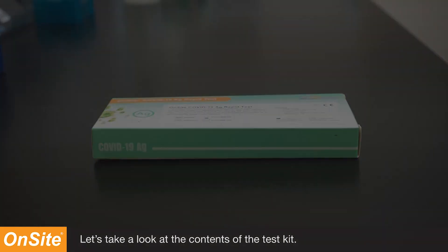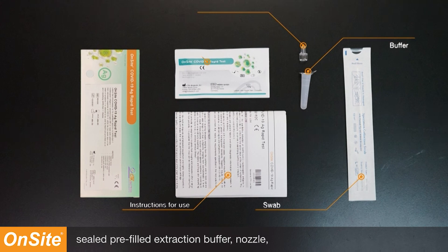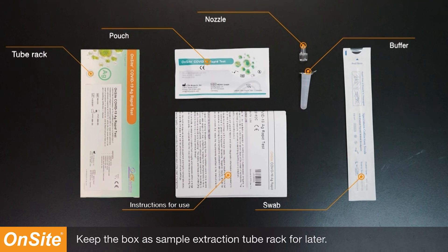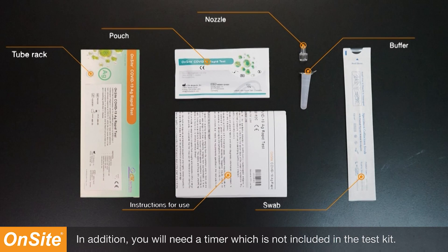Let's take a look at the contents of the test kit. Our kit contains instructions for use, swab, sealed pre-filled extraction buffer, nozzles, and individually sealed foil pouches. Keep the box as a sample extraction tube rack for later. In addition, you will need a timer, which is not included in the test kit.